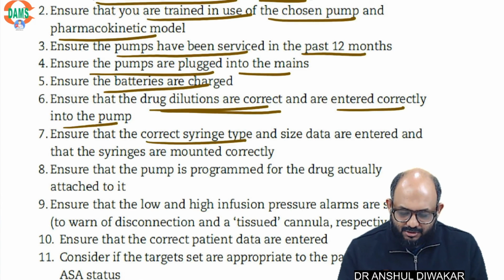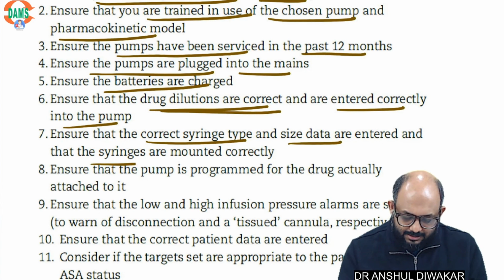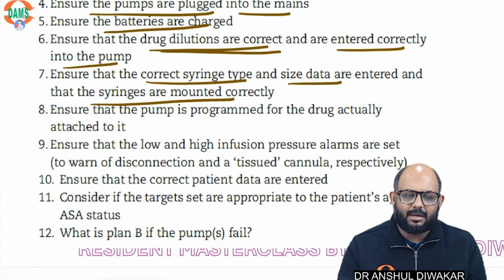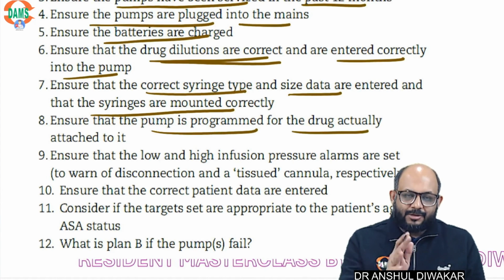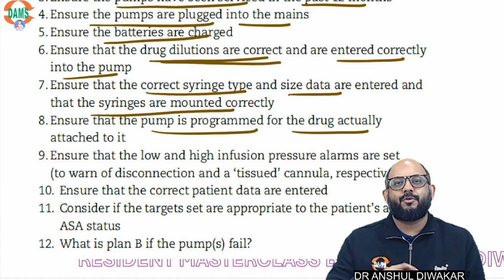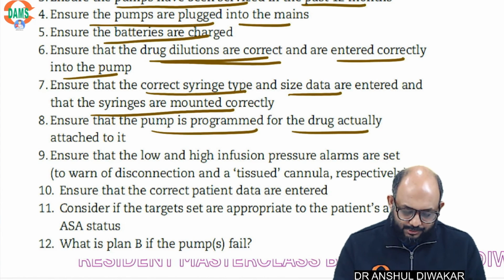Ensure correct syringe type and size data are entered and the syringes are mounted correctly. Of course, there are alarms for everything. Ensure that the pump is programmed for the drug actually attached to it, and not that you attach propofol but use the model of remifentanil.